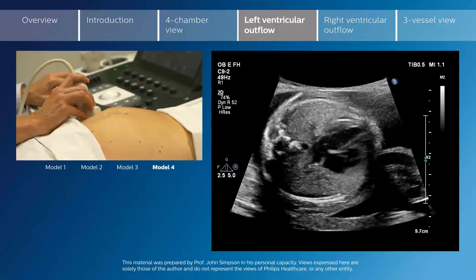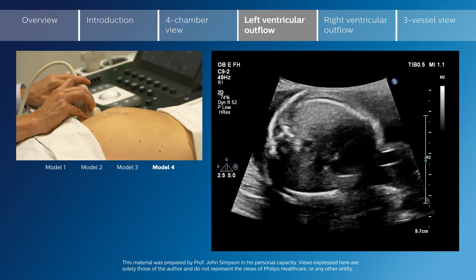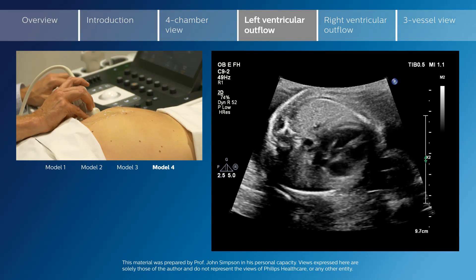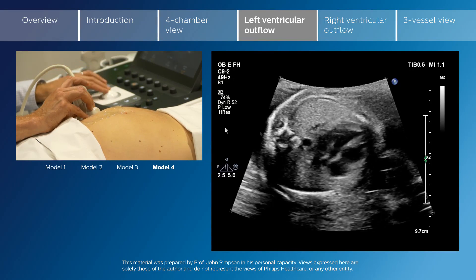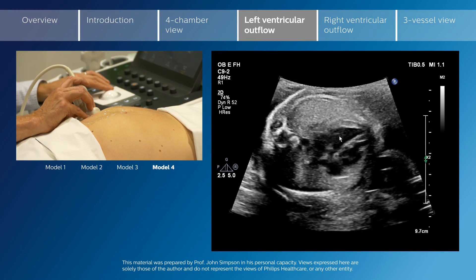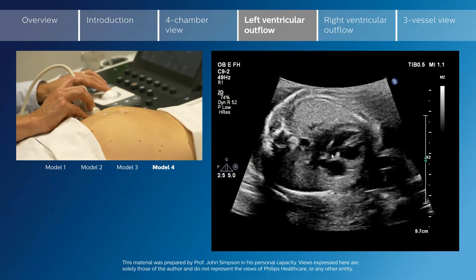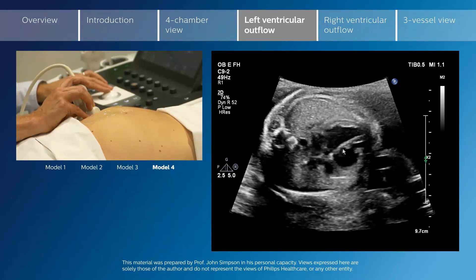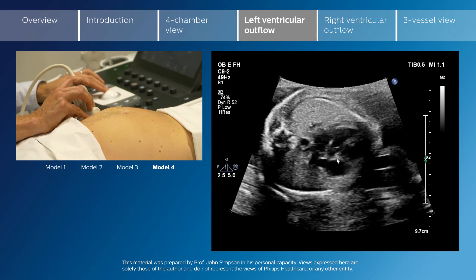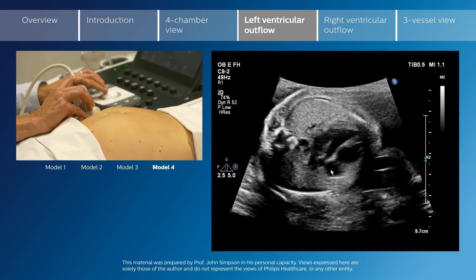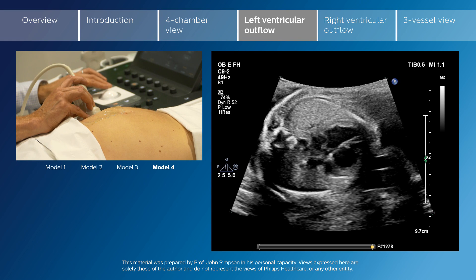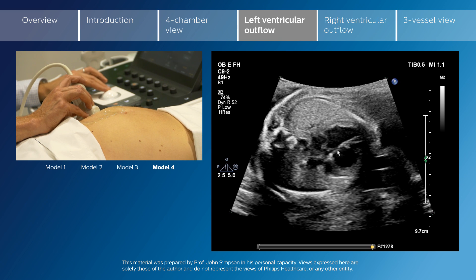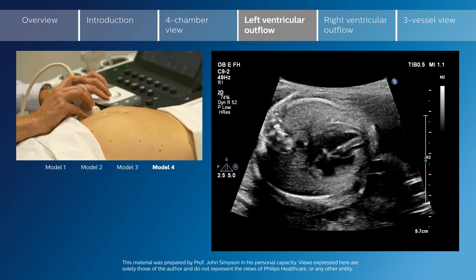As we angle the probe towards the fetal head, the first vessel which we see is the aorta, which leaves the left ventricle and heads towards the right shoulder of the fetus. The aortic valve should be seen to open and close here, which is normal. The septum and anterior wall of the aorta should be one continuous line, as seen here. This line of the ventricular septum and anterior wall of the aorta should be one continuous line so that the aorta is completely committed to the left ventricle.